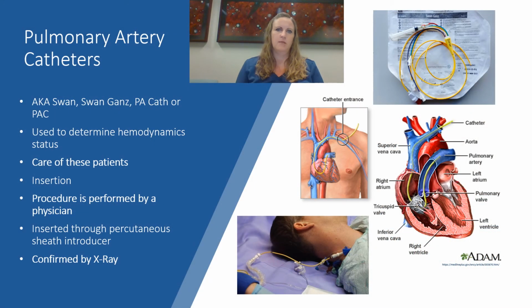So let's talk about these pulmonary artery catheters. They are also known as SWAN, Swan-Ganz, PA-Cath, or PAC. They are used to determine hemodynamic status in critically ill patients and are used to aid diagnosis and guide therapeutic intervention. This includes administration of fluids, diuretics, and also vasopressors.